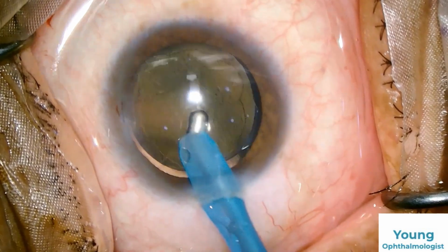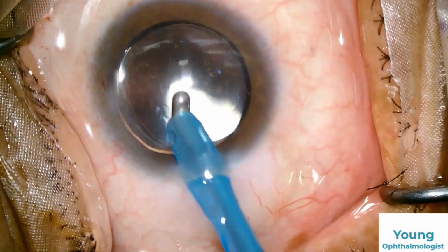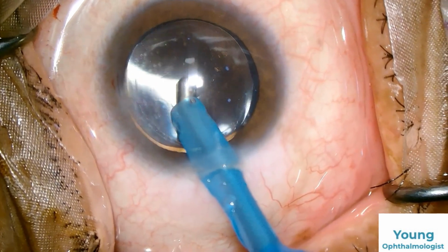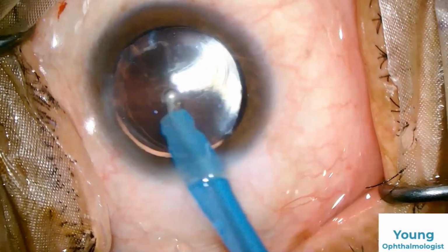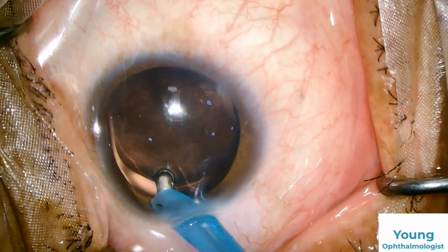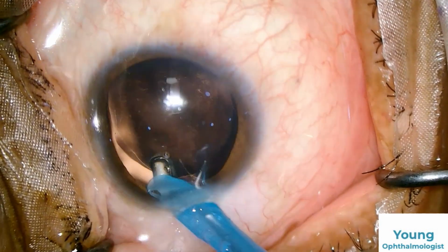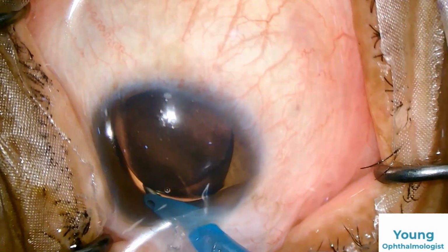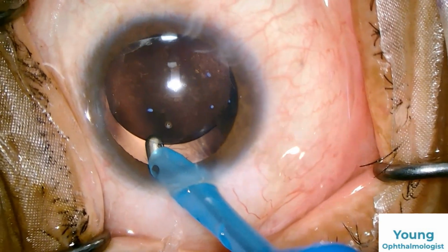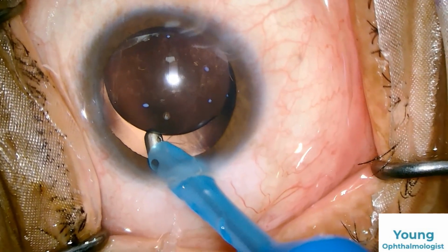Doing the AC wash of visco. Angle should be cleared properly. Now my favorite step, going behind the IOL, lifting the edge of the IOL and washing behind the IOL.